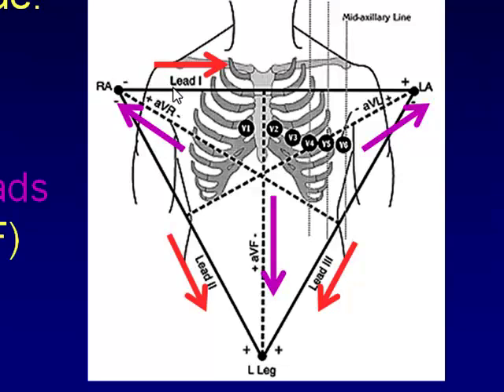Yes. You have to remember, because lead 1 is looking to the lateral side. Okay, very well, look here. So lead 1 is telling us the lateral portion of the heart. Yes. And also aVL, because it goes in this direction. Yes, aVL from the center to the left arm. So it's telling us about the left side of the heart also. And so on and so forth for the other leads. You have to remember this.